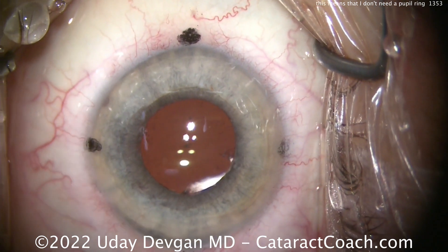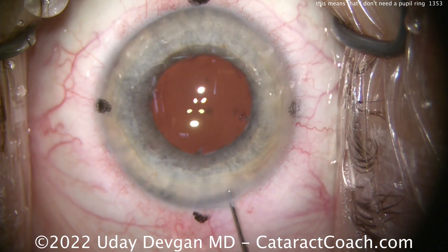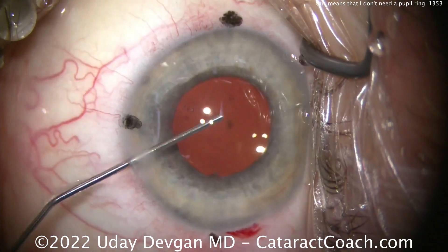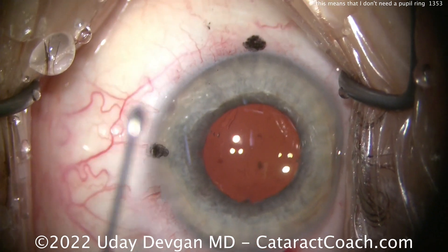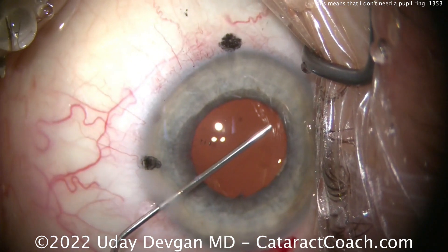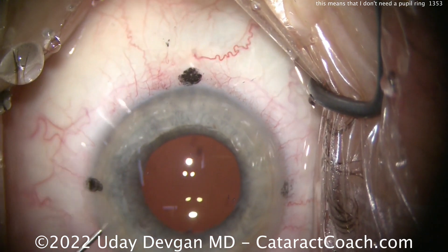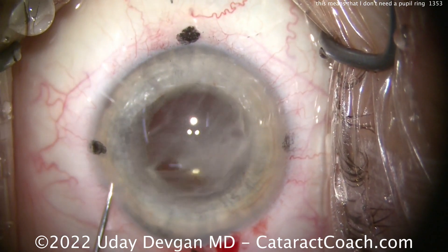As you can see, it's a pretty efficient case. The key thing I used at the beginning — prior to creating the capsulorhexis — was those forceps marked at two and a half and five millimeters from the tip to measure the existing pupil. If I already have a four and a half or five millimeter pupil like in this case, I'm basically done. You don't need more than five millimeters of dilation, because you're going to do a five millimeter capsulorhexis. We measure it, confirm it's good, get the capsulorhexis done, partially prolapse the nucleus out of the capsular bag — the nucleus helps hold it still — then chop it and finish the case.